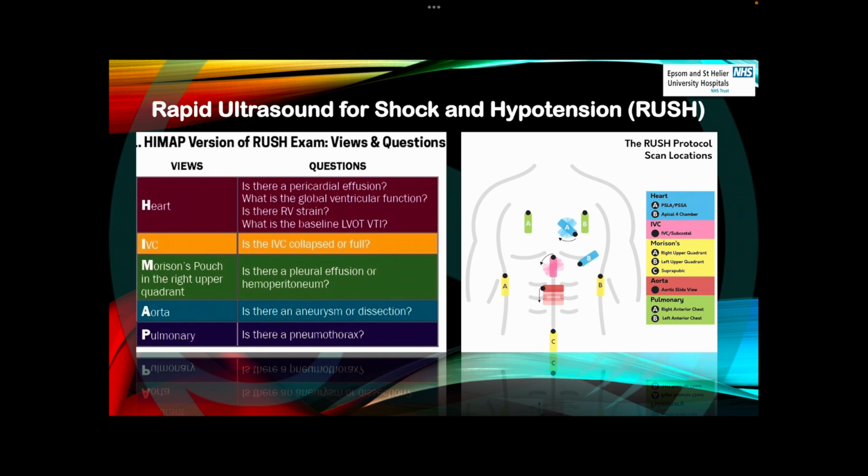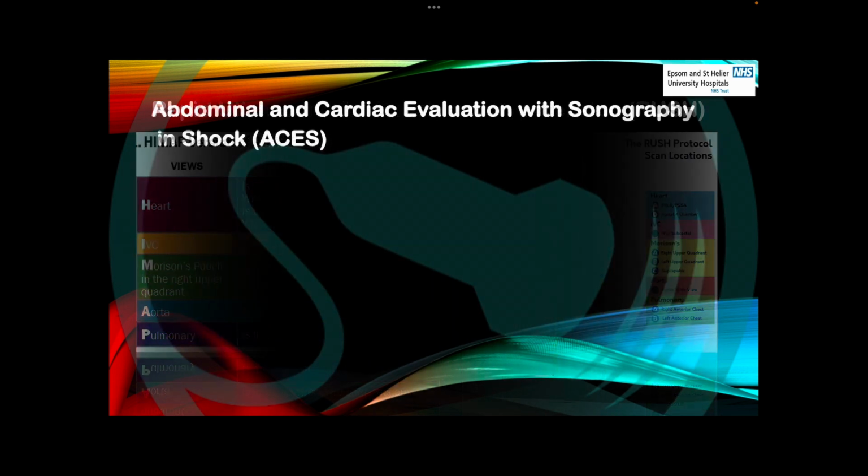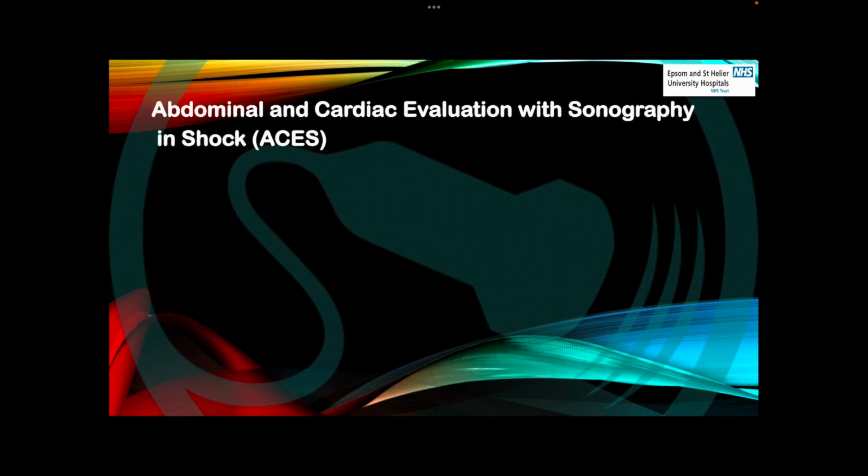Pulmonary area, is there any pneumothorax? Also here, these are the places where we put the ultrasound probe in order to reach the final diagnosis and manage the patient. All right. There is another protocol, we call it the Abdominal and Cardiac Evaluation with Sonography in Shock, ACES.